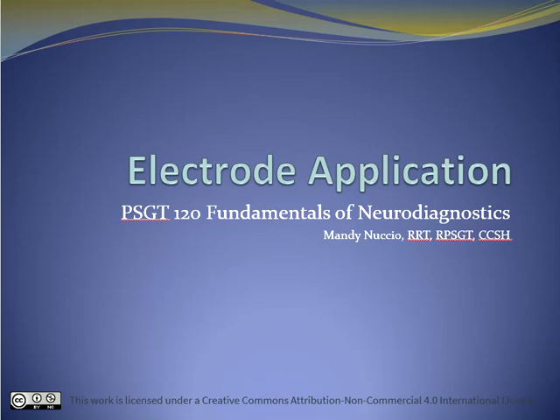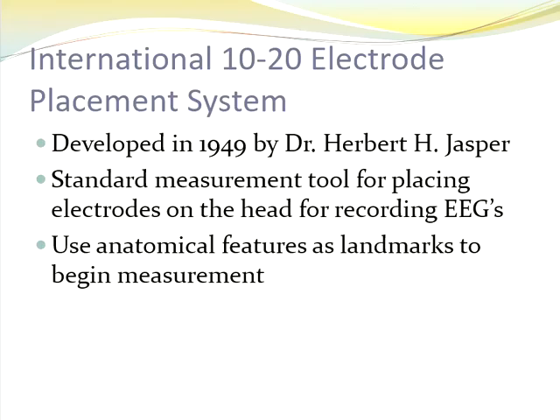Electrode application. Last week's talk on the sleep lab equipment focused more on the technology that we utilize in the sleep lab, on all the different pieces of equipment that we utilize. This talk will be more on specifically how we apply all of that equipment. So let's start with how we apply the head wires.